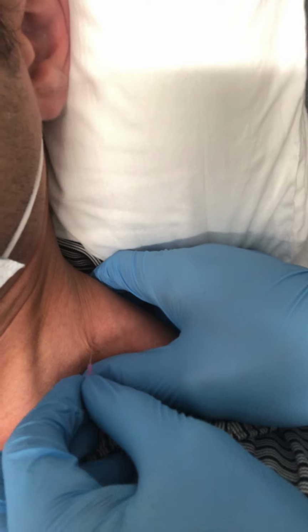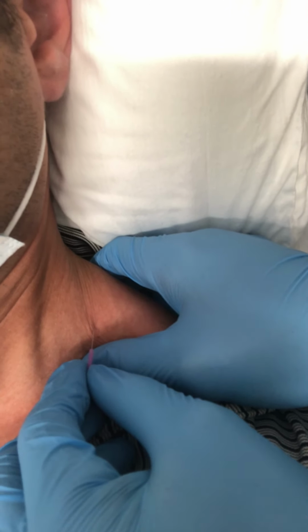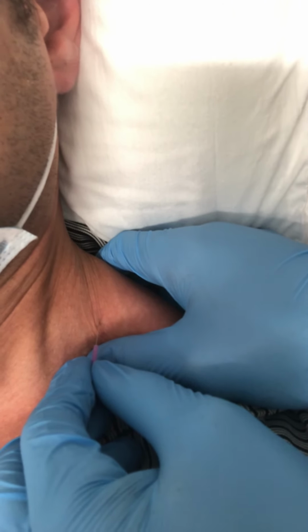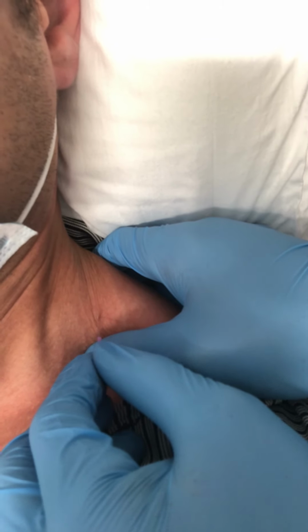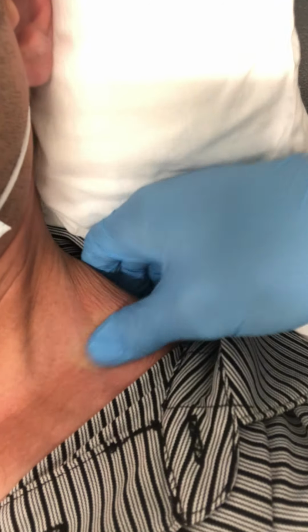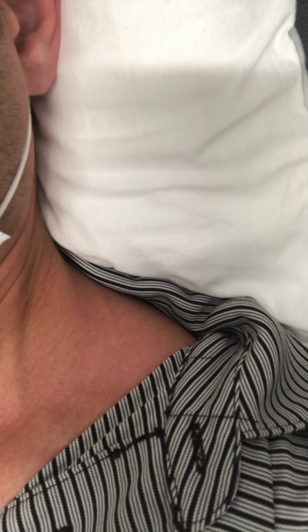Okay. So I'm going to twist that needle. I would twist that needle, and if we were doing an actual treatment, we would leave that in there for a few minutes to let that tissue release, okay? To get those fibers aligned. But today, since we're just showing you guys for a demo, we're going to take that back out. Okay. Do one more, kind of see if we can get another response there.